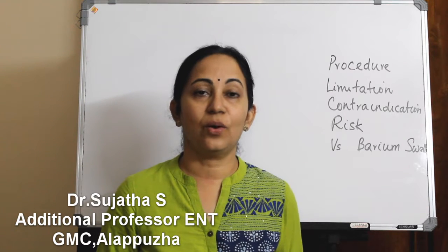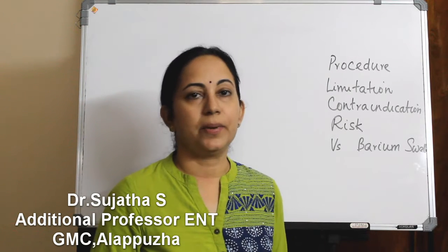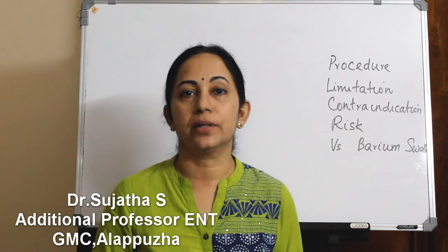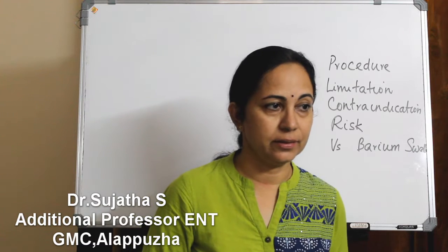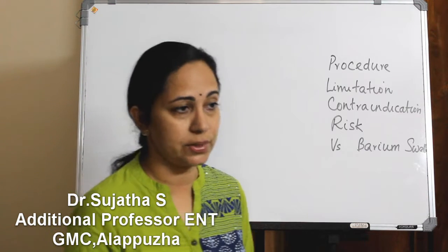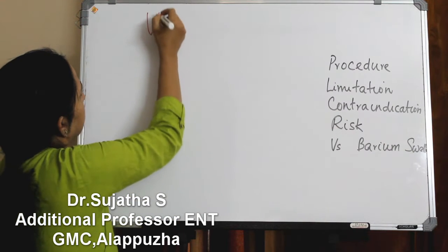As a continuation of classes on dysphagia, today I'll explain the gold standard investigation for swallowing disorders. What is the gold standard in the investigation and diagnosis of dysphagia? The investigation is videofluoroscopy.